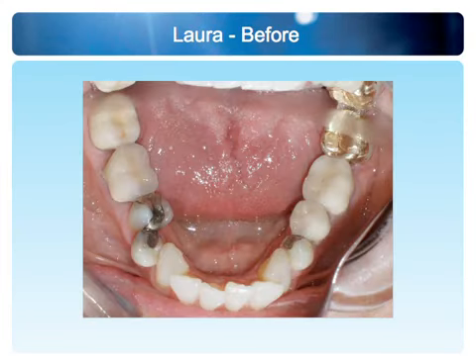And we can see here the amount of crowding that's associated with having the improper arch form. And when you look at the posterior teeth more closely, you see how they're leaning in towards the tongue. They are leaning in so far that all we can see is the entire buccal surface, all the way down, including the concavity here. So that's an amazing lean that these teeth have. They need to be upright. And we can upright those teeth, and by doing so, improve the occlusal forces on the posterior segment.